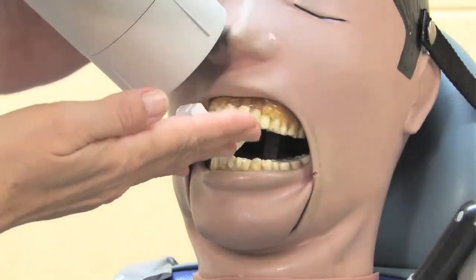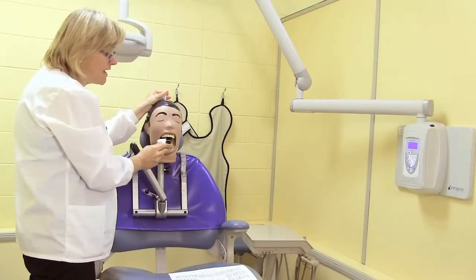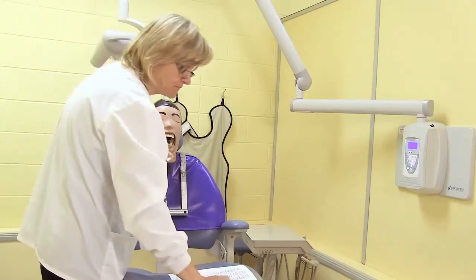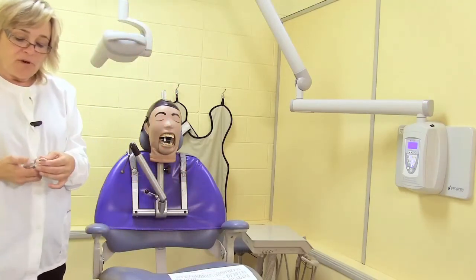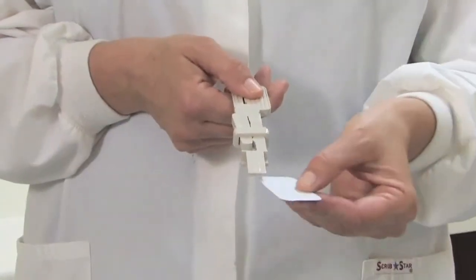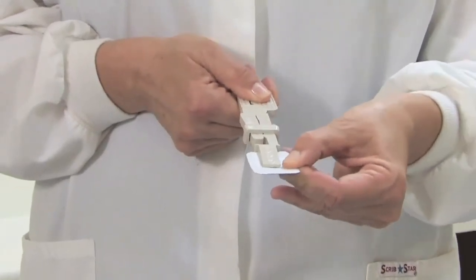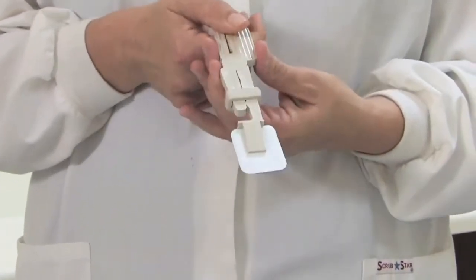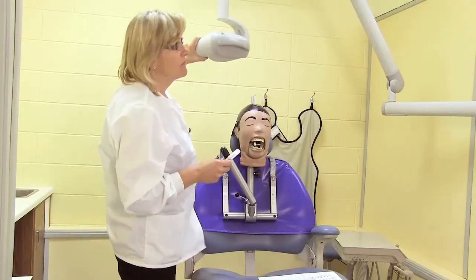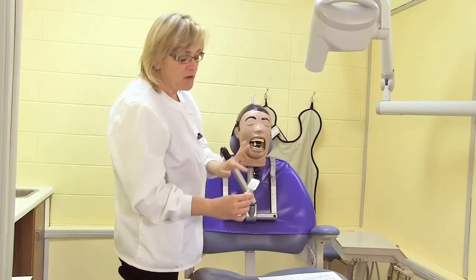I take my exposure. Remaining on the right side, obviously I would use the same technique and probably the same angulation for the left side canine. Now with the snap array, the film placement for the anterior, this is the bite tab. Again, remember, dot in the slot, because the dot, when mounting the film, should be present at the incisal or occlusal edges. So for a quick anterior display, here's the bite tab.